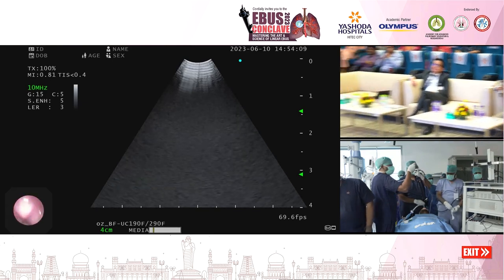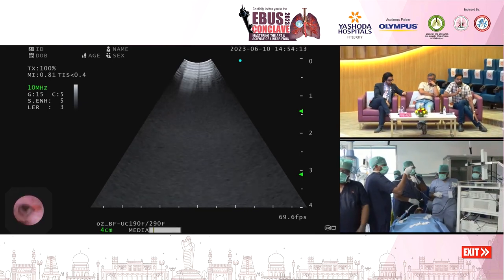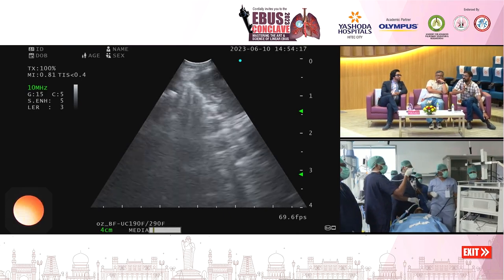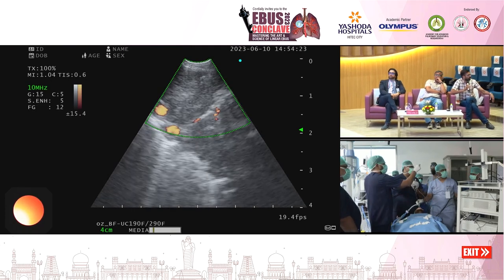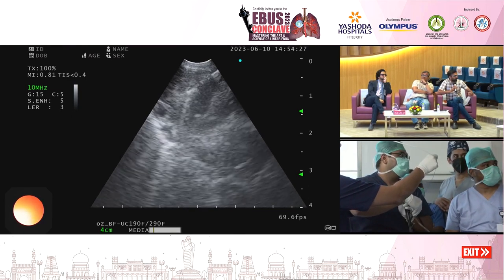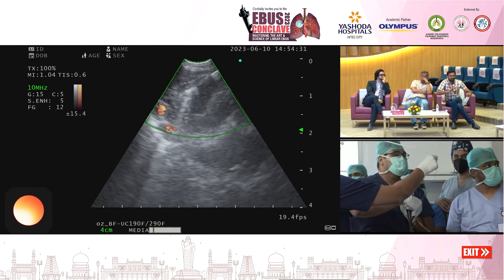This patient is in an artificial airway and completely sedated. But for those doing it under moderate sedation, this could be a little challenging. To keep the track which we had seen in the same place and pass the cryoprobe inside becomes difficult. The patient might be breathing rapidly or might cough, and we might lose the track. So that is one other thing.